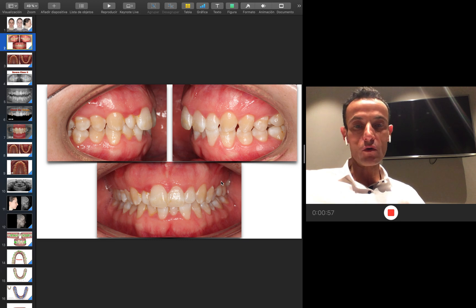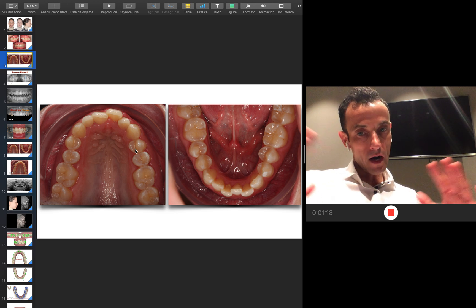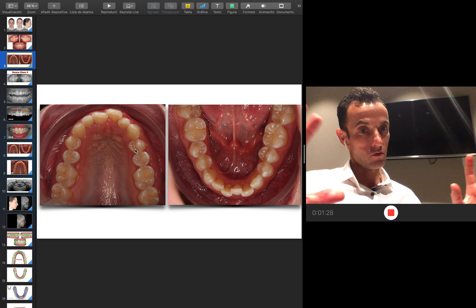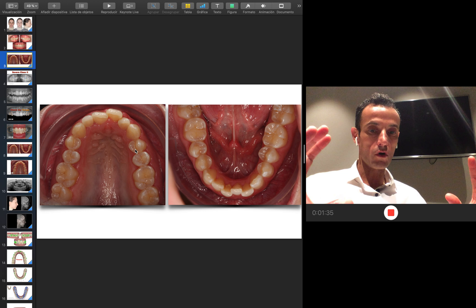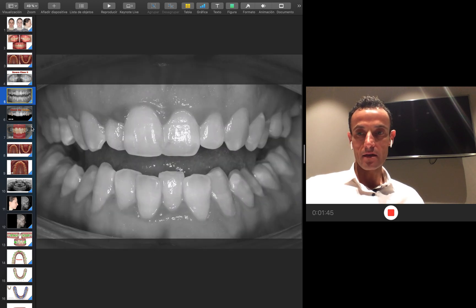One of the difficulties of the case is the small lateral incisor. Look at the crowding and the narrow arch in both sides. As you know from my work, one of the main things we have to do at the beginning is check the shape of the arches. In the lower arch there is a narrow arch with molar rotations, but something very good I like in this case — the sevens are over-expanded in the lower. We have to pay attention to that in order to place attachments in the back to upright them and maintain good control, and also to plan the right moment to do the IPR. You can see the severe crowding.